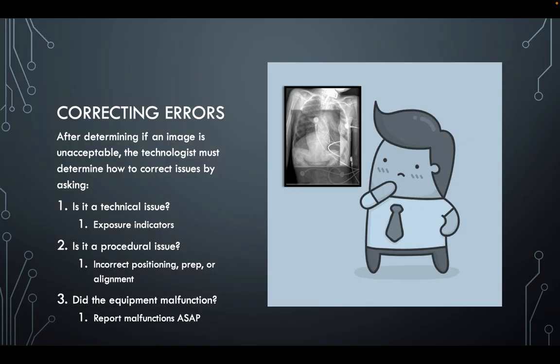So if you ever see that happen, where the white border outside of your collimation is showing up, or the machine automatically crops and it crops out all the usable anatomy that you wanted, look at your exposure indicator before you fix it. And I guarantee you it will change when you get your image opened up to what you want to actually send to the radiologist.